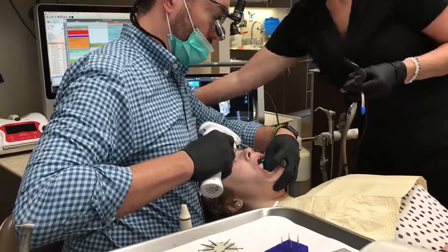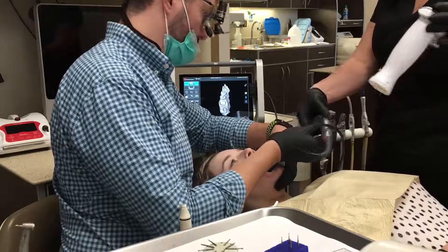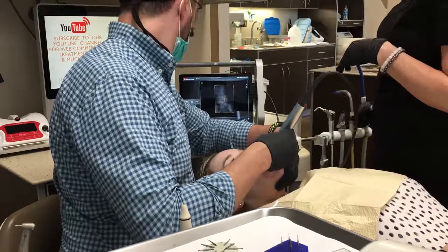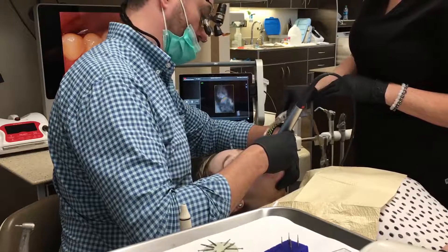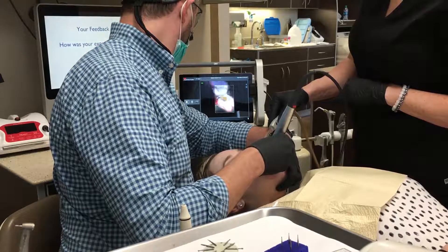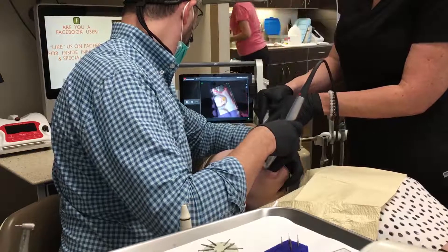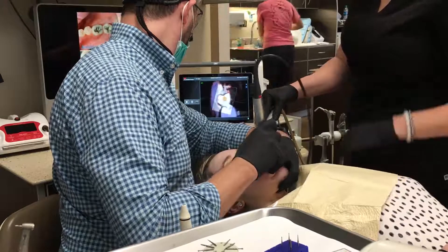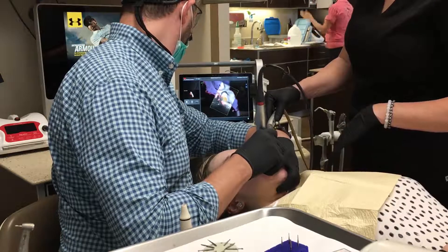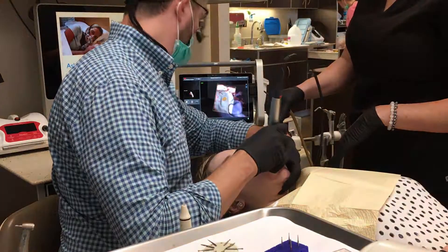On the lower opposite this, we're going to capture the same information. We isolate — it's a little bit more difficult on the lower because of the tongue, but a cotton roll does really good. Now we're going to capture the lower just like we did the upper, going from the second molar to the canine. That's a very typical scan for a single unit crown. If we're getting into more than a single unit — two or three unit crown — sometimes we'll go to the contralateral canine or do a full arch. The goal is to try to get everything gray to turn red and then red to turn white, and it happens pretty quickly.